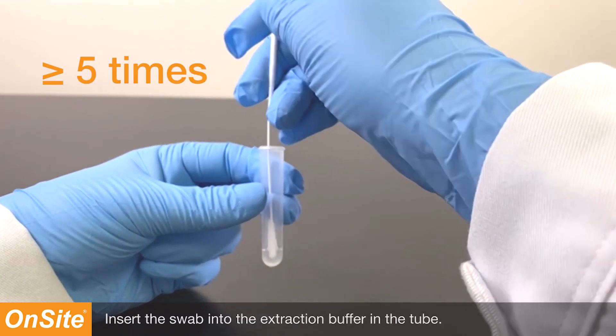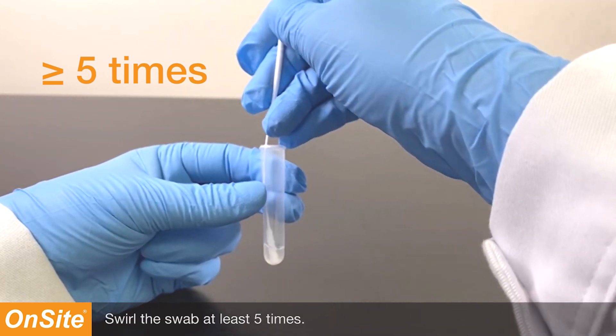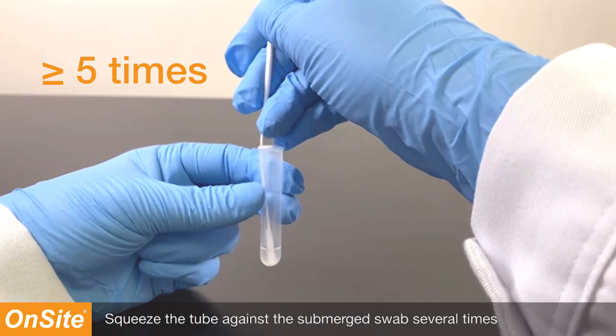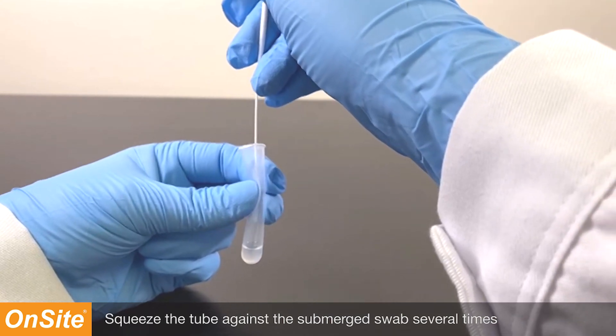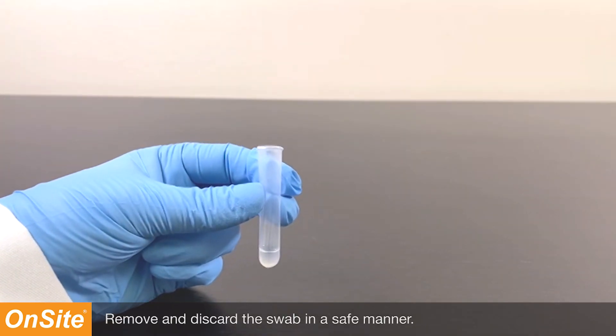Insert the swab into the extraction buffer in the tube. Swirl the swab at least five times. Squeeze the tube against the submerged swab several times to facilitate extraction of the specimen. Remove and discard the swab in a safe manner.